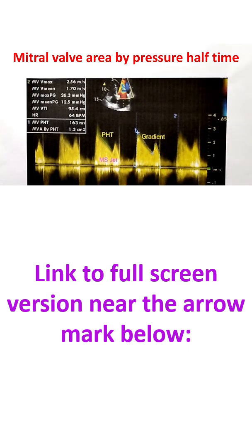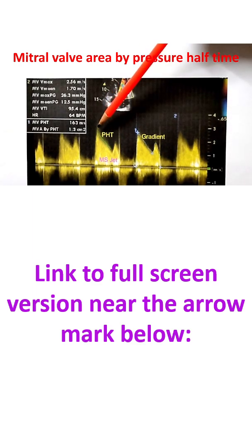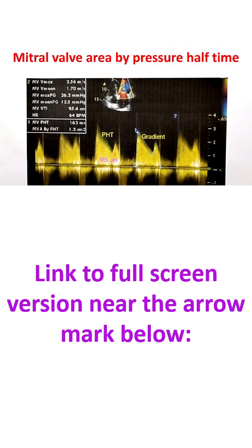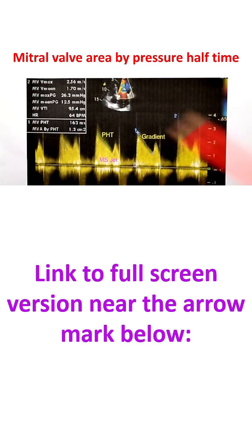You align the cursor along the mitral jet and get a good Doppler tracing. All you have to do is mark the slope from the peak of the E wave — this is the mitral E wave and this is the atrial systolic A wave. Just mark this slope and the machine will calculate it. In mitral stenosis, when the gradient is continuous, there is no diastasis and these two waves are rather fusing.